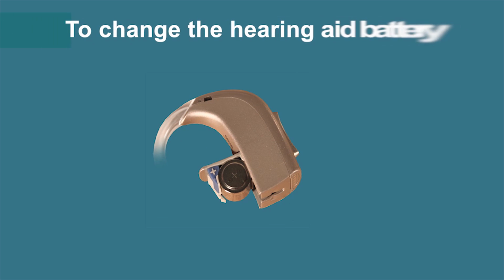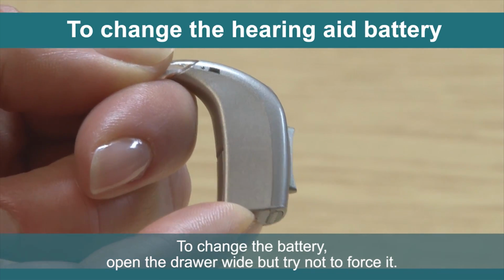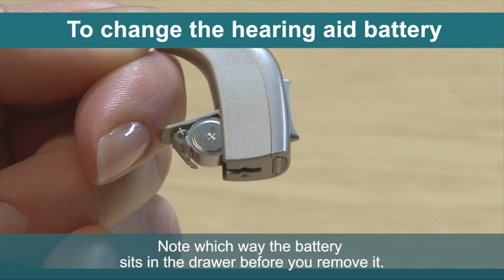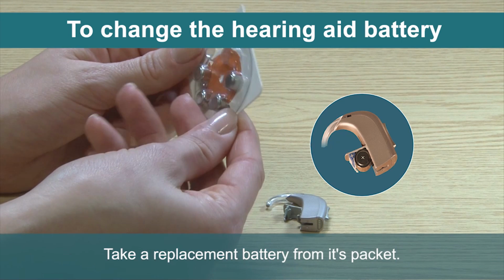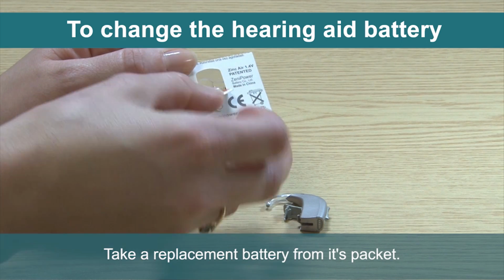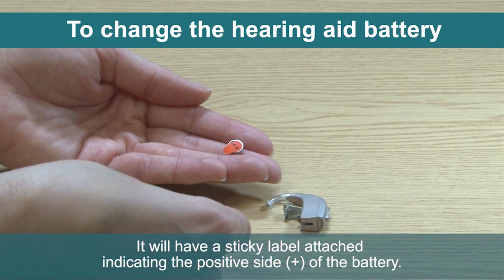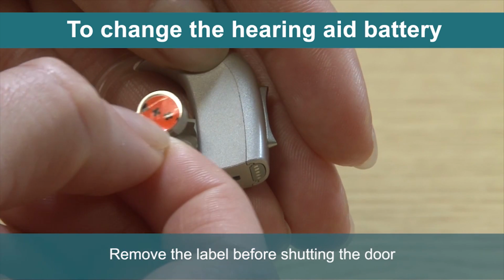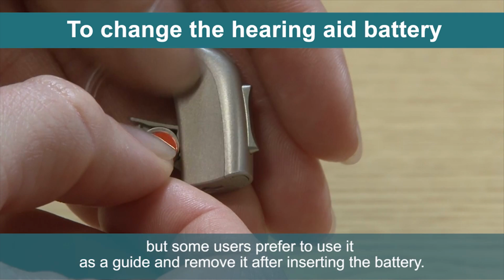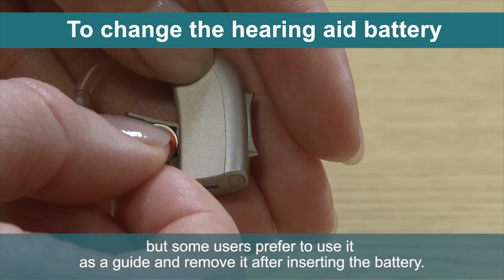To change the hearing aid battery. To change the battery, open the drawer wide, but try not to force it. Note which way the battery sits in the drawer before you remove it. Take a replacement battery from its packet. It will have a sticky label attached indicating the positive side with a plus sign of the battery. Remove the label before shutting the door, but some users prefer to use it as a guide and remove it after inserting the battery.